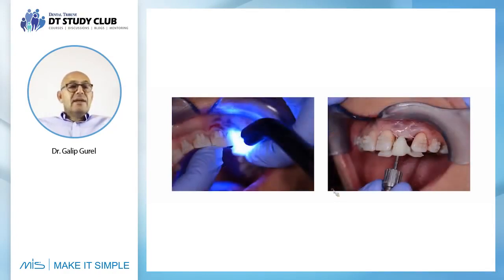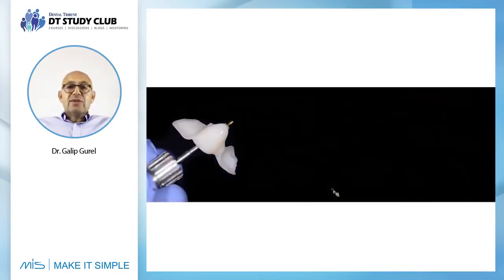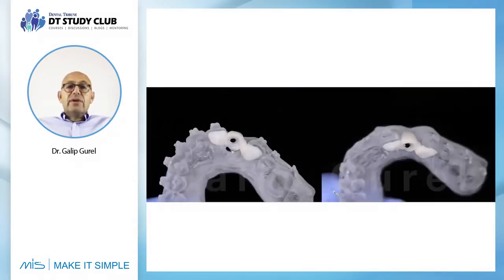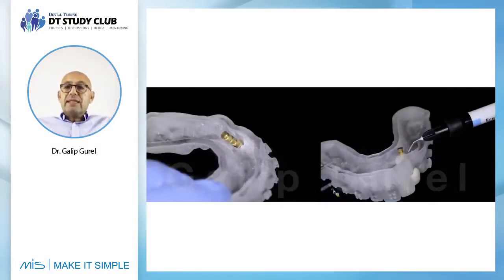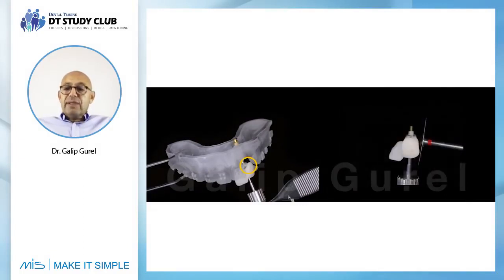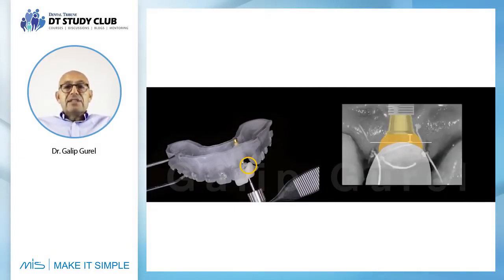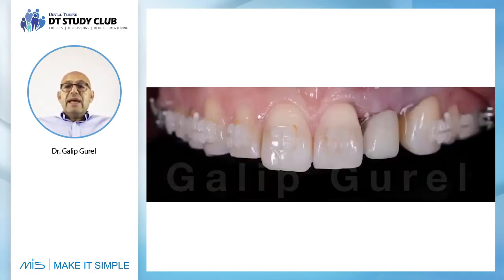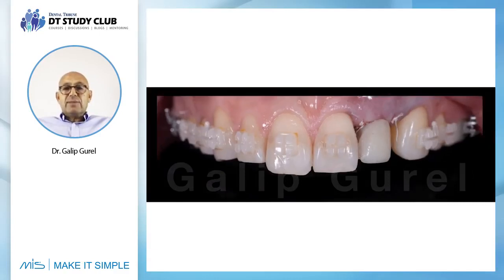You see we will be capturing it, and the wings are providing us with the most stable position of this lateral. We light cure it, we take this out, and now simply in the lab we are drilling a hole into this stereolithic model representing the position of the implant. We're securing this with composite, and this is the zone that we will be dealing with, just like I mentioned previously. So this is only this 1 millimeter that we have to match, and once we do this, we're just cutting the wings away and placing this into the patient's mouth.